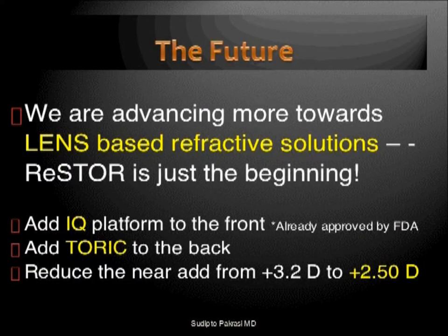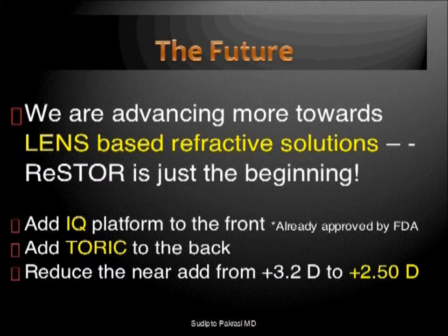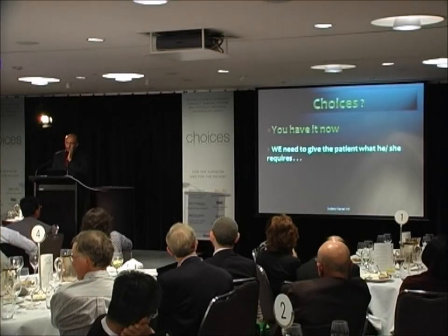So in conclusion, we are moving forward towards more lens-based technologies for refractive solutions, vis-a-vis only the cornea-based. So there has to be an amalgamation of the two, a combination of the two. So we better understand this. And these have been done. One very interesting thing being done is to reduce the near add of the IOL from 3.2 to 2.5. And this should also be available in the near future. I don't know when. But what this will do is, for people who have intermediate vision requirements, it should be a better option. So it's another choice being added to your armamentarium. So we have choices of nearly everything.